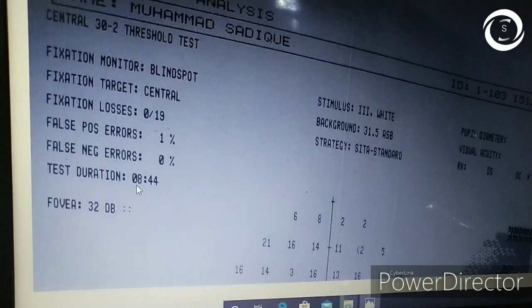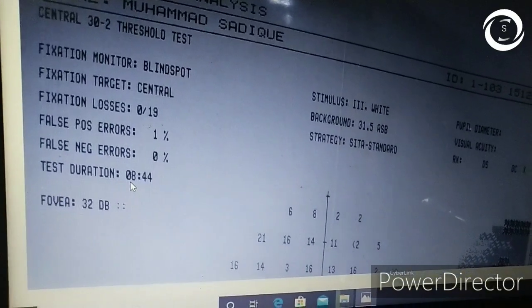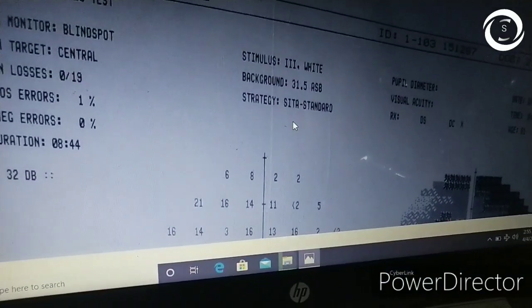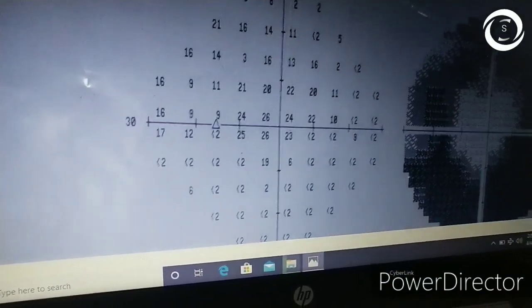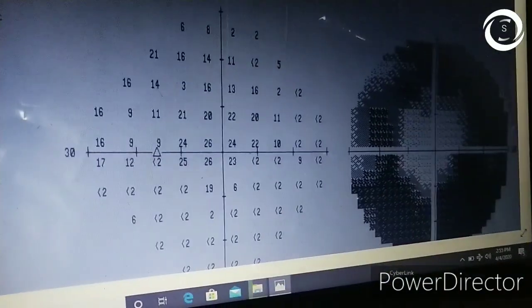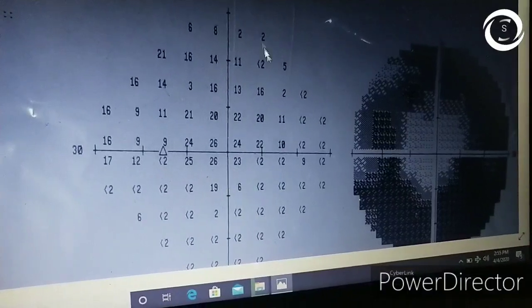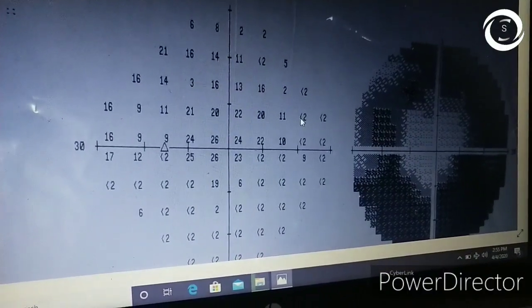Looking at this patient's reliability indices: fixation losses are 0, false positives are 1, and false negatives are 0. So this is a very highly reliable test.